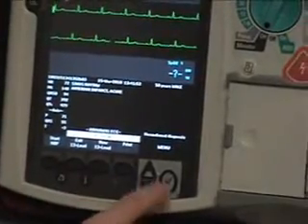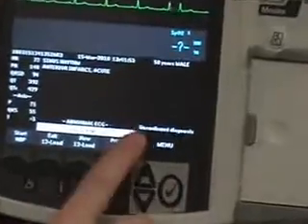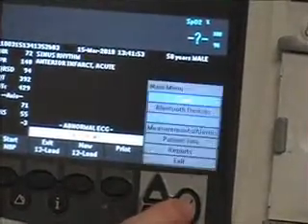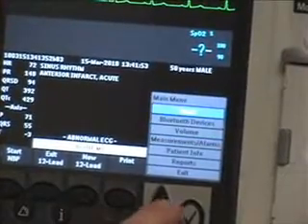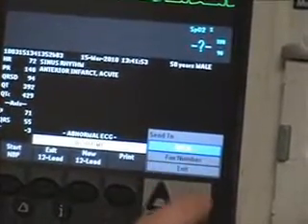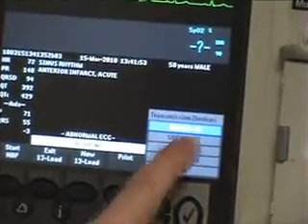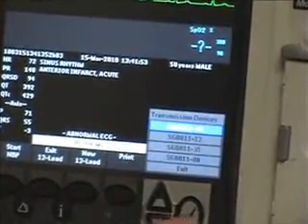The first step is getting it to the Toughbook. We've already acquired our 12-lead and we're in the 12-lead menu. We're going to hit Menu and go up to Send. EPCR is what's default — we're going to select it. Toughbook 44 is the one we're using, so we'll make sure we've got the right Toughbook.